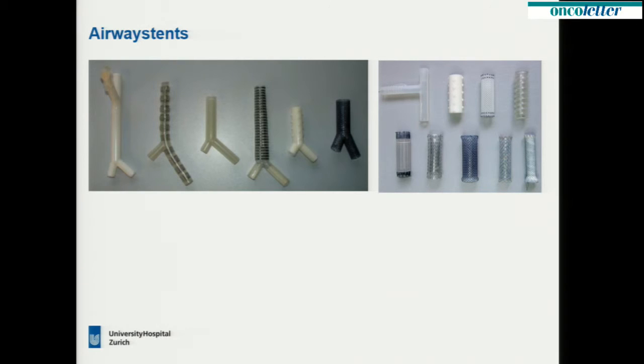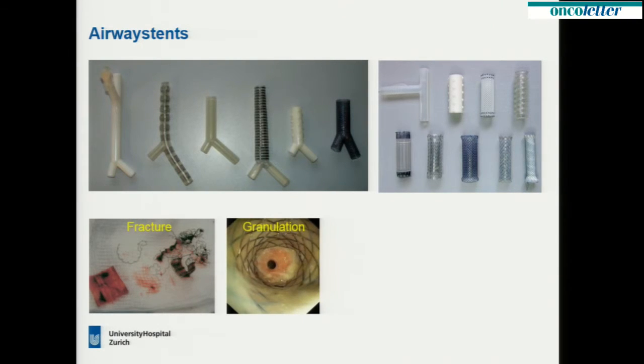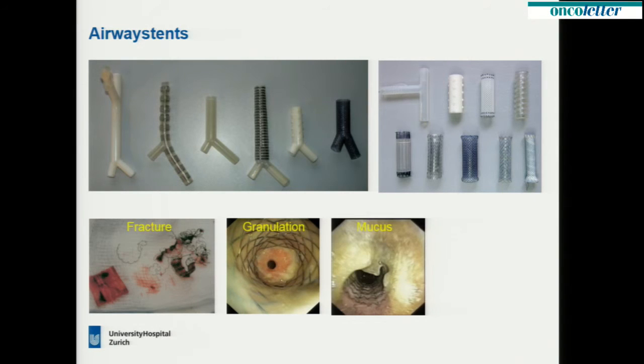A stent sounds very nice, however, a stent should be the last treatment option because stents do have very many complications. First is the stent fracture. It is very hard to extract a stent which is broken, and you can grab out on the mucosa, which is very bleedy. A stent can granulate, so there are different attempts to overcome this problem by giving some medications on the surface of the stents. However, at the moment there's no good result in these investigations.